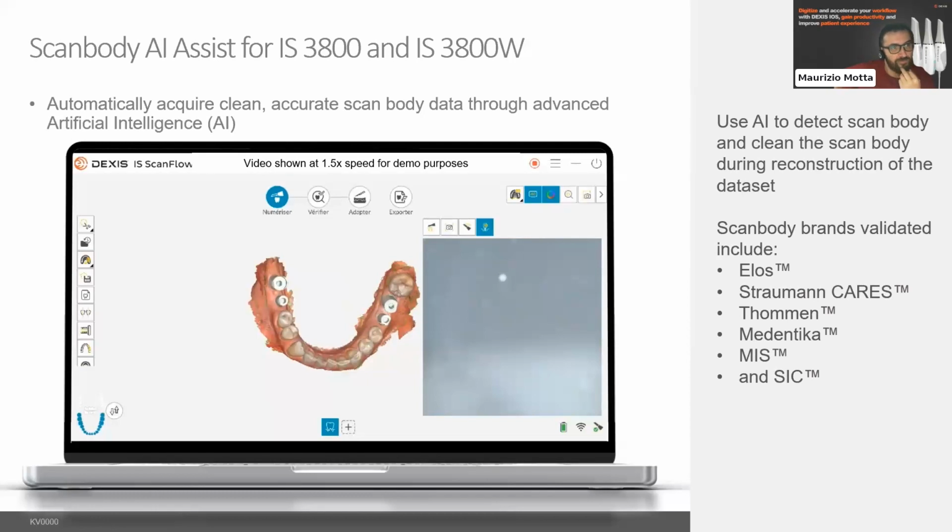What is your suggestion for one scanner where the scan time is around 40 minutes, and the laptop is strong? It depends what is creating that 40 minute delay. If the scanner is actually struggling to scan and the laptop is really powerful, maybe there is some problem with the calibration.